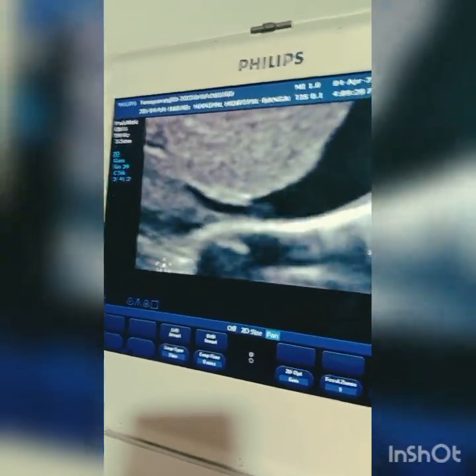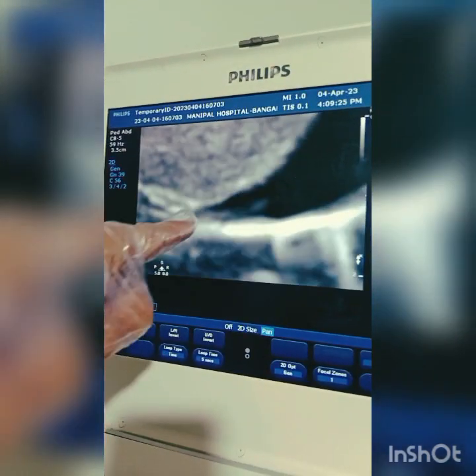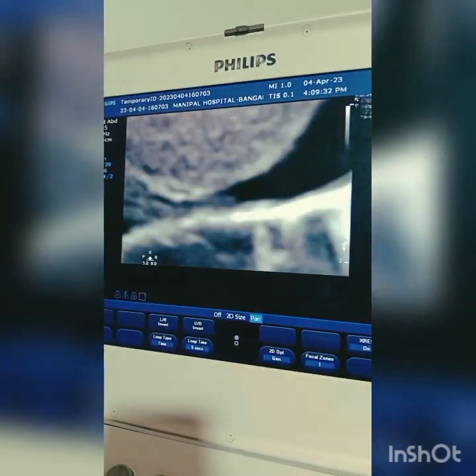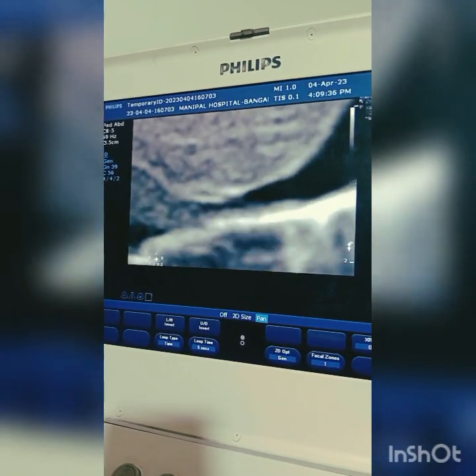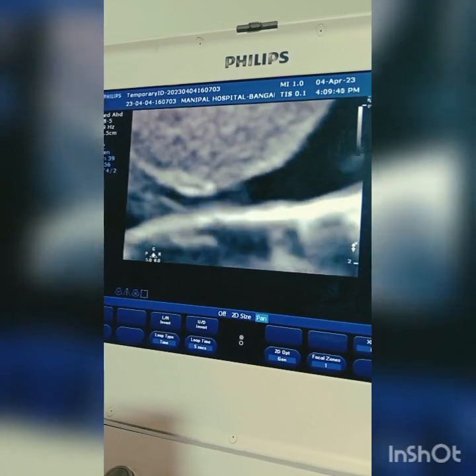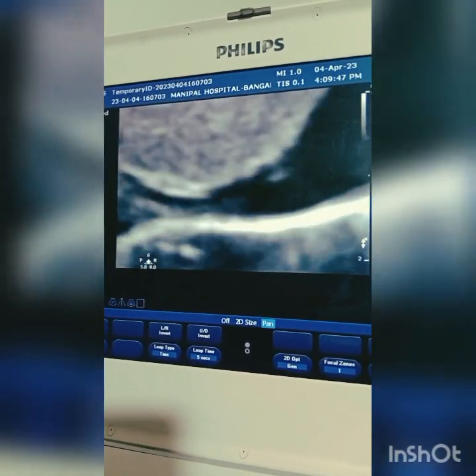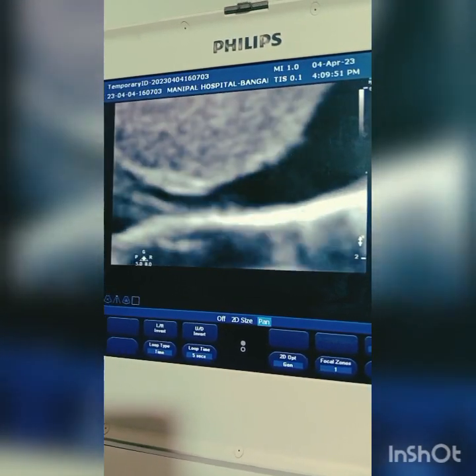I'll zoom in. You can see that the tip is at the junction of the inferior vena cava and the right atrium. You can see the flow — this is the confirmation of the tip of the PICC line using bedside ultrasound. This will definitely prevent the need for a chest X-ray, which has more ionizing radiation. Ultrasound is safer, faster, and reduces turnaround time.